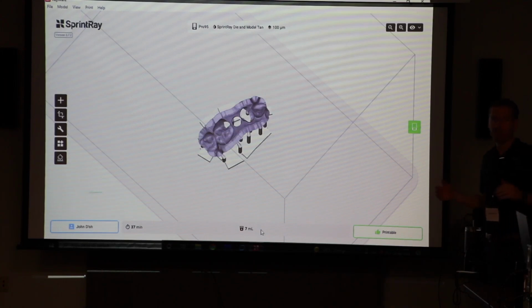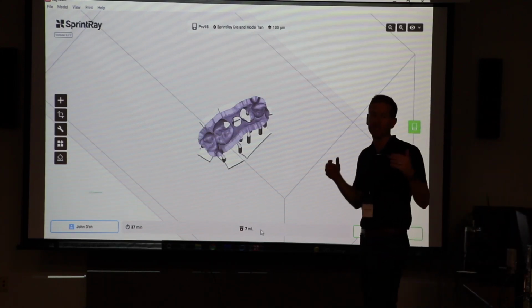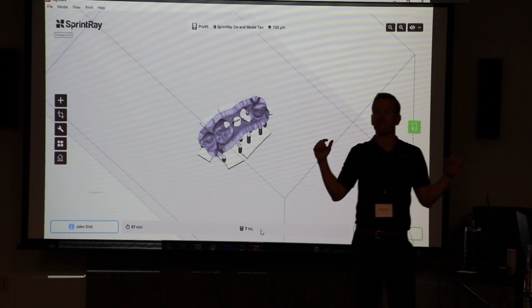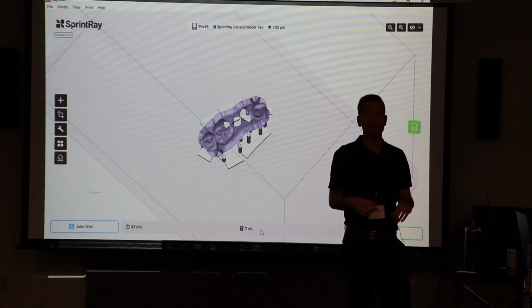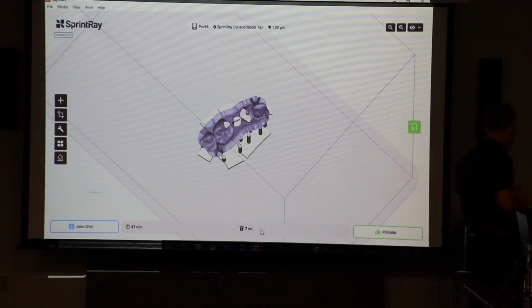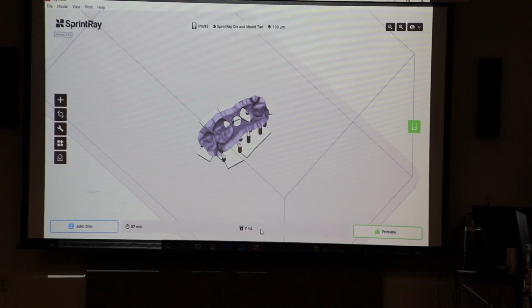We did a lot of theory this morning, a lot of understanding the whys. We're going to try to drive in and get everybody to go start to finish, make sure we get a guide start to finish, try to get a print initiated and completed before we get out of here today. So let's go back to Blue Sky.